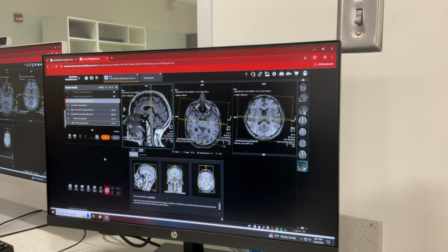Alright, should we move the post one above the inject then, or no? No, we have to inject first and then run the post image. Okay. Yep, so that looks good the way it is.